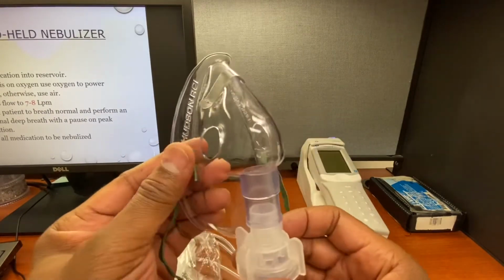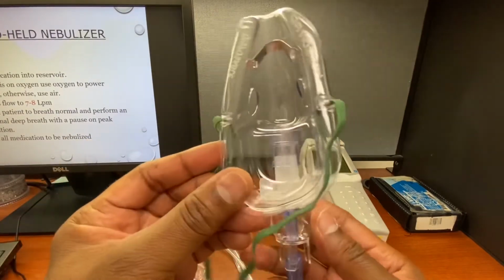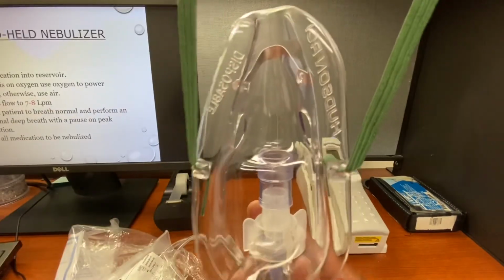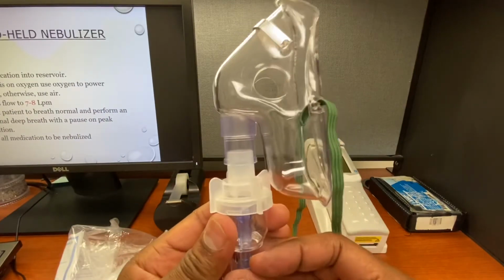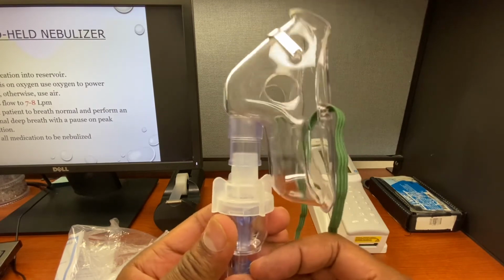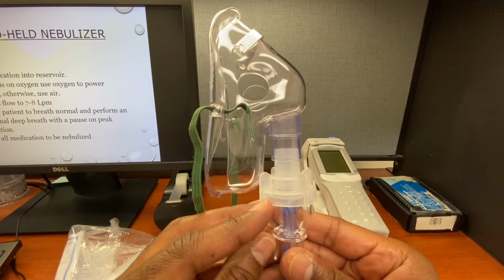Now, the aerosol mask wouldn't be great for those who are claustrophobic, but if they're unconscious, this is the perfect way to deliver medication. You just put it over their head and turn it up to 7 or 8 liters, and you can give the medication this way. Small volume handheld nebulizer with an aerosol mask. A great way to give medication.